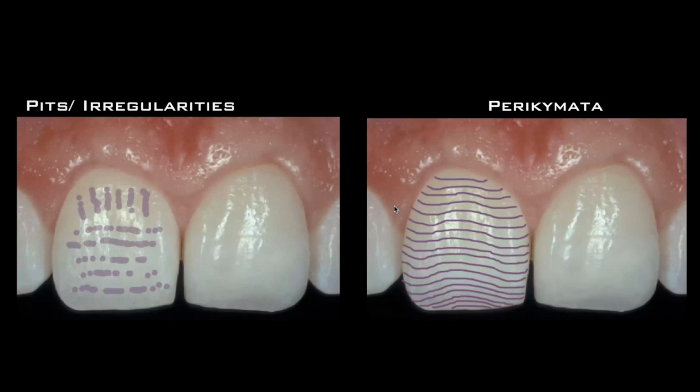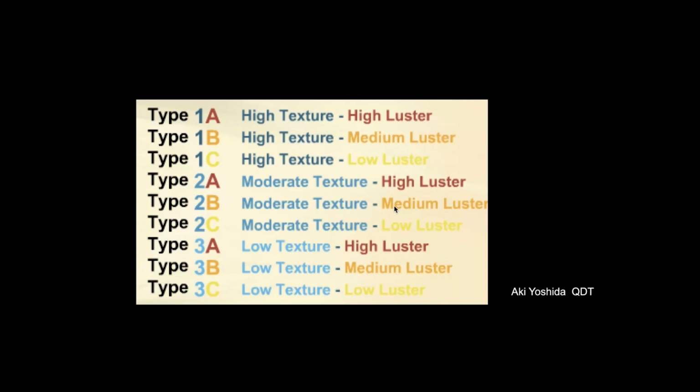And if you don't have this chart, I suggest you take a picture of this. You'll see type 1A is high texture and high luster. What does that mean? Easy. Type B, high texture, medium luster, still not so difficult. And then high texture and low luster, all controlled in the polishing at the end. Here's where they start getting more difficult. Type 2A, moderate texture, high luster, kind of works. Moderate texture with medium, and moderate texture with low is much more difficult, because I don't want to lose that texture as I'm polishing away to lower the luster of my restoration, or as I'm polishing up to raise the luster.